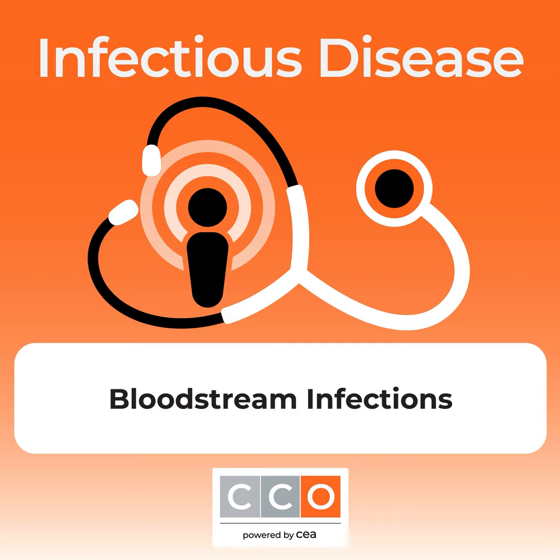Of all of the different rapid diagnostic tests we have available, the MALDI-TOF has been the most widely adapted technology in recent years and really the most variably applied platform for the identification of bacteria and yeast based on each pathogen's unique protein profile.